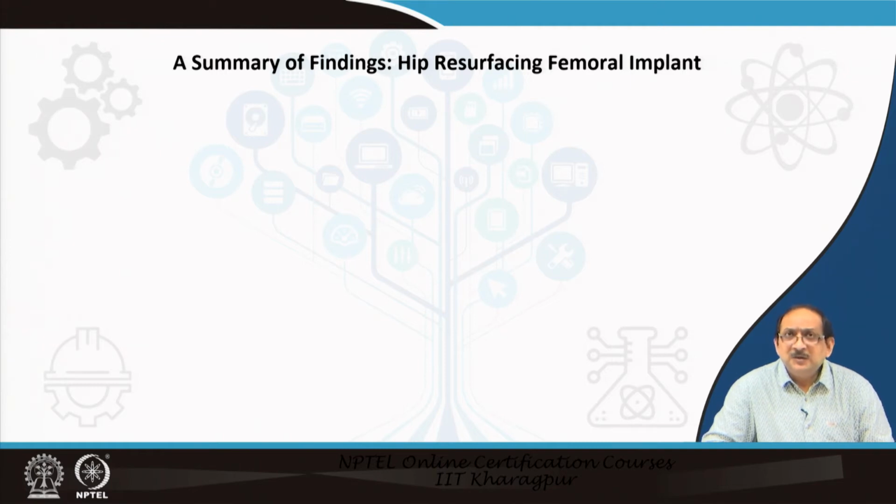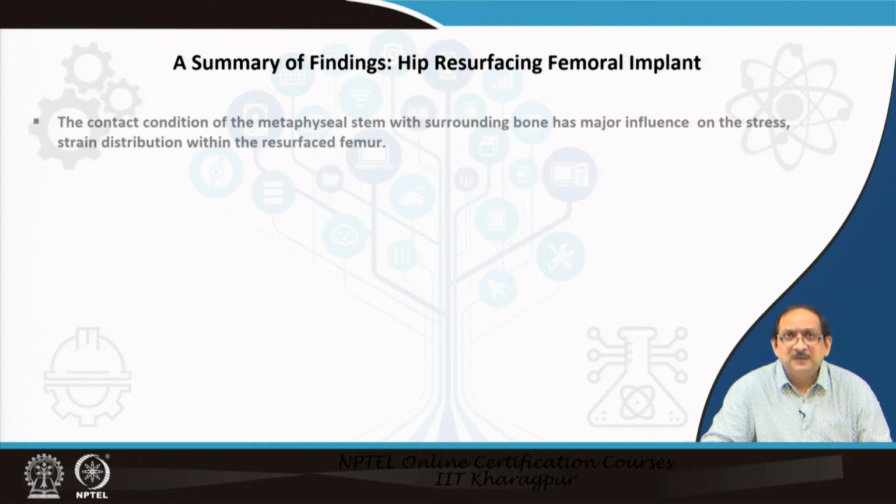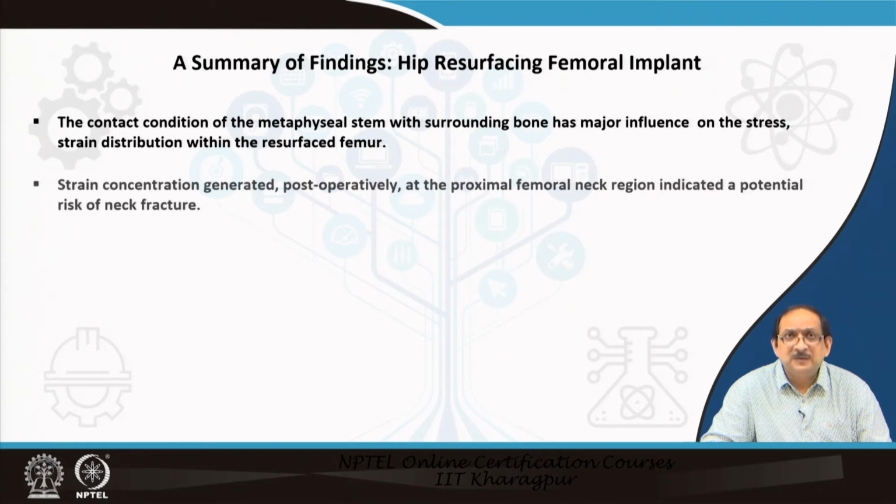Let us come to the summary of findings in case of this hip resurfacing femoral implant. The contact condition of the metaphyseal stem with surrounding bone has major influence on the stress-strain distribution within the resurfaced femur.